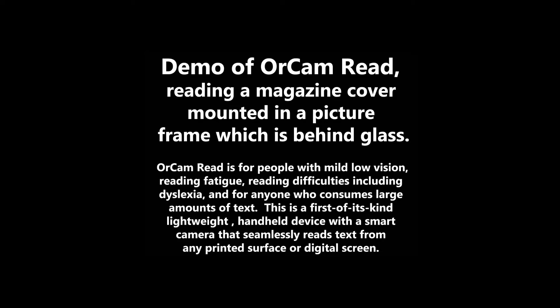This is a demo of OrCam Read reading a magazine cover mounted in a picture frame, which is behind glass. OrCam Read is for people with mild low vision, reading fatigue, reading difficulties including dyslexia, and for anyone who consumes large amounts of text. This is a first-of-its-kind, lightweight, handheld device with a smart camera that seamlessly reads text from any printed surface or digital screen.